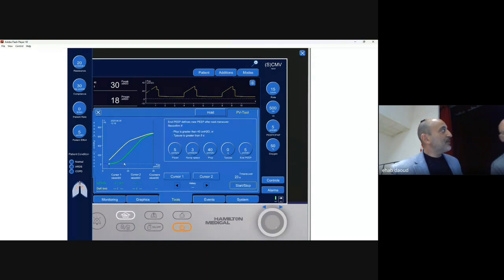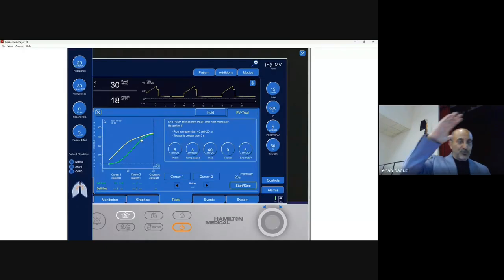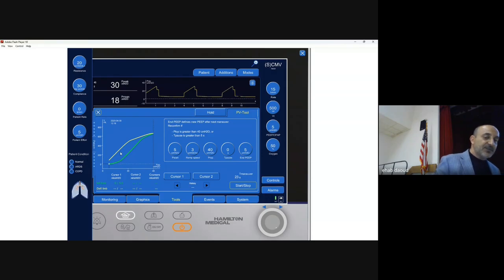It's okay. Some people also look at the lower inflection point. This part here, sorry, if you're going to use APRV and the top pressure, you can see it's beaking. So that's probably, you shouldn't exceed pressure than here. There is other stuff which I know they didn't put the pause, but if you see the pause and you calculate the area of the maximum hysteresis to the change of volume when you put the pause at the end, usually it's called NMD. And if that ratio is more than 41, studies show that this lung is recruitable. But that's the only thing I want to.